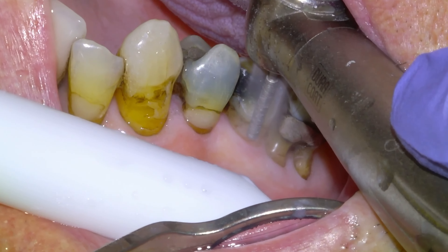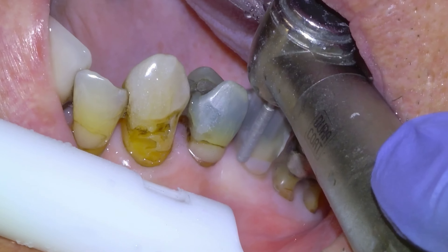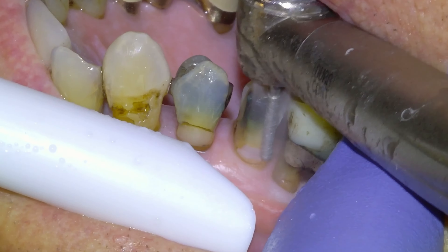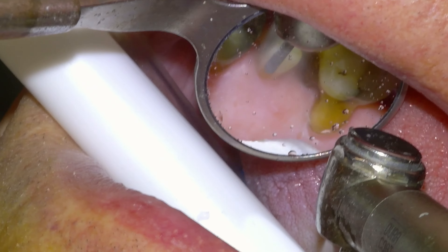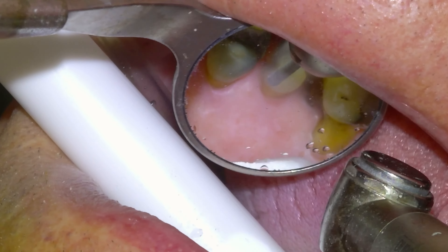We're going to get going with the prep — occlusal reduction first with our KS1, and then we'll do our axial reduction, just taking it about a millimeter deep with a deep chamfer until we're back on tooth structure. There's no need to put any of the margins subgingival.